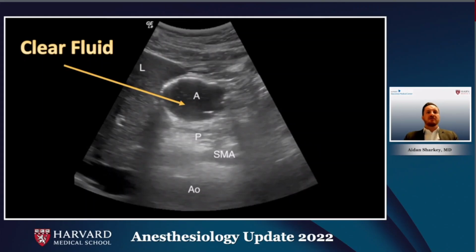The physical process of swallowing is inevitably associated with swallowing of air as well. Thus, recent consumption of clear fluids or carbonated drinks can produce air bubbles within the fluid that may appear as hyperechoic dots, as seen in the anterior portion of this image of the stomach.